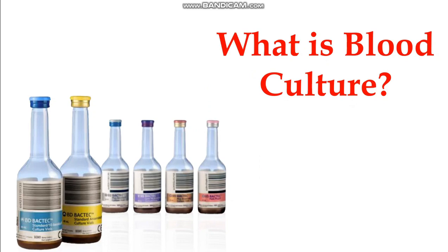There are three main things we achieve with blood culture. We confirm if the patient has an infection, we pinpoint the specific organism causing the problem, and most importantly, we provide the doctor with the data they need to choose the best antibiotic for the patient.